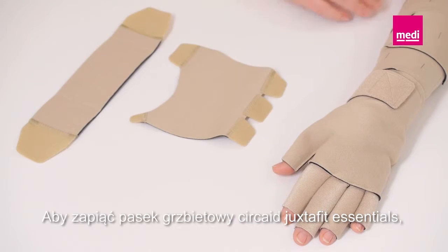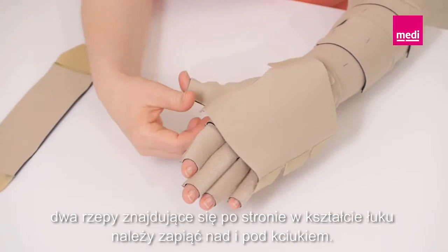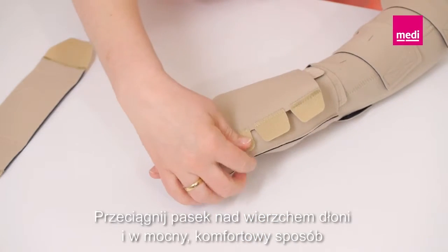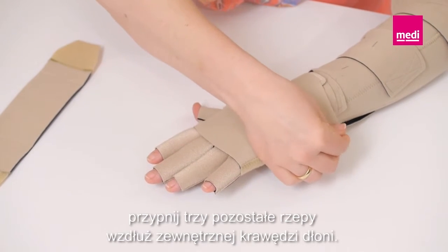To fasten the Circade Juxtafit Essentials dorsum strap, attach the two Velcro tabs of the crescent-shaped side above and below the thumb. Pull it across the back of the hand with firm and comfortable tension and secure the remaining three Velcro tabs along the outer edge of the hand.